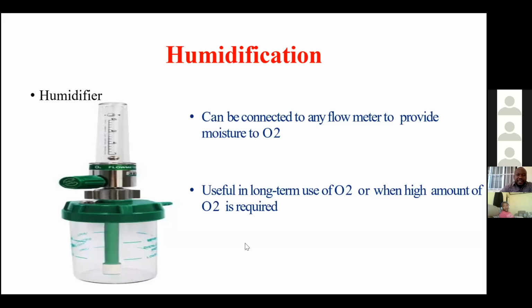So while we are still waiting for him to come, let me continue by telling you all those delivering oxygen using either low or high flow oxygen devices. You may need humidification or a humidifier for nasal cannula oxygen delivery. When we are at less than 5 liters, we may or may not use the humidifier. It's not needed then, but we need it when we go above 6 liters.